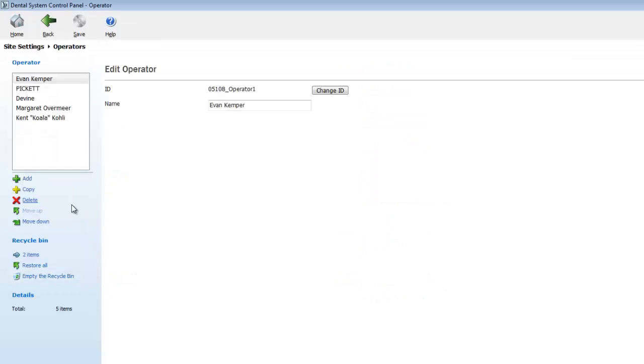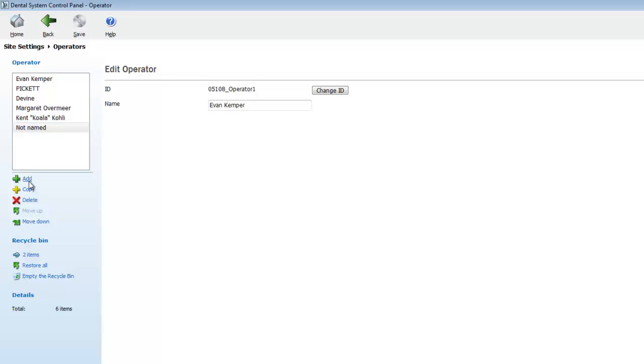This will bring up a window with a list of operators. If we look down below that list, we'll see a plus sign that says add. Click on the add button and it will create a new operator. Next, we highlight the text and delete it. Now we can type in our operator name.